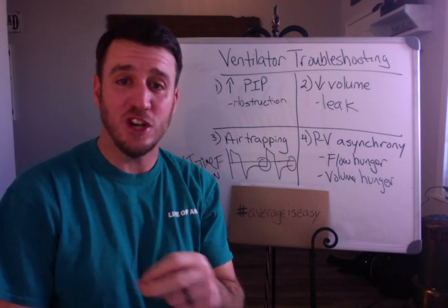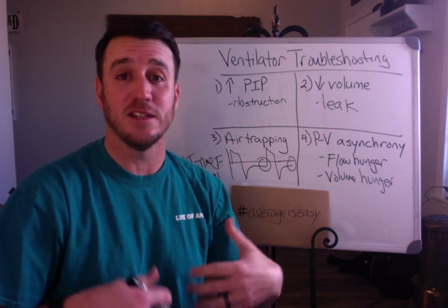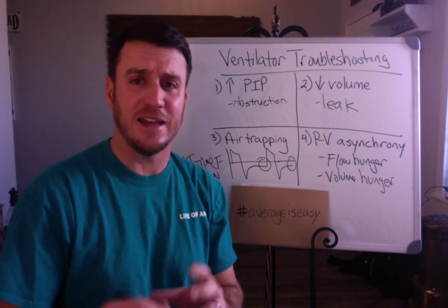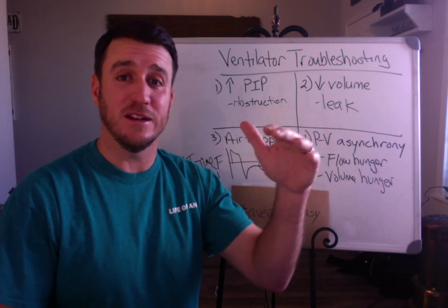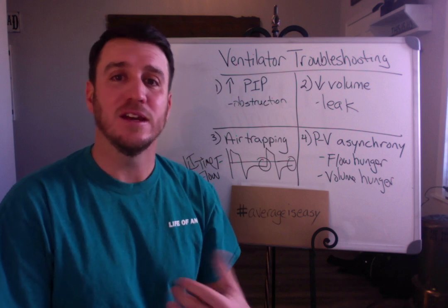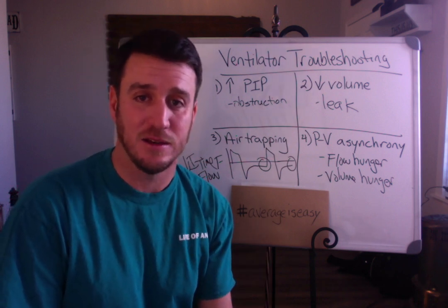Now, the way this shows up is while you're taking care of the patient, and you have a patient that is on assist control, AC/VC, volume control, or SIMV. It can happen in either of those modes. You have a breath that's given, and then immediately after that, you see another breath given. And the question is, why is this patient breath stacking?